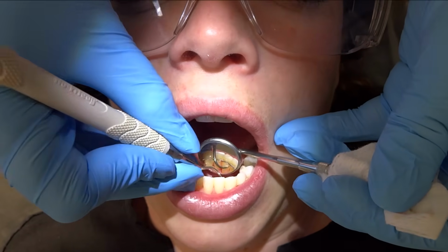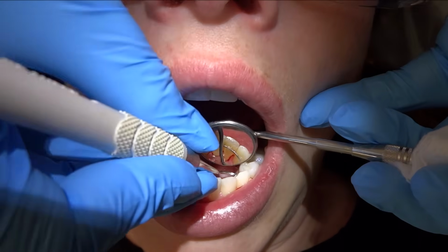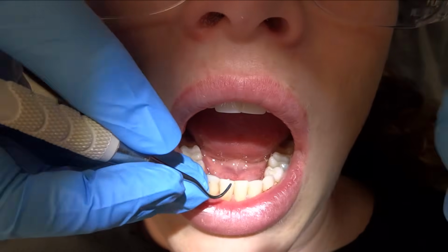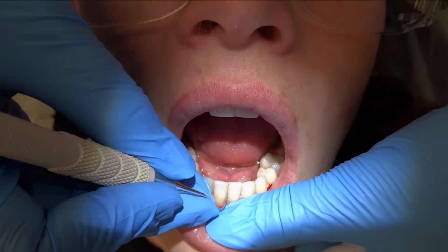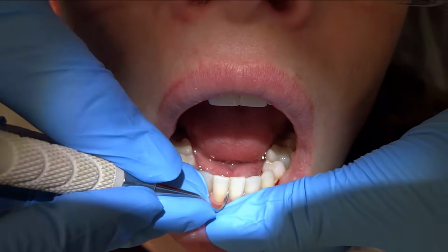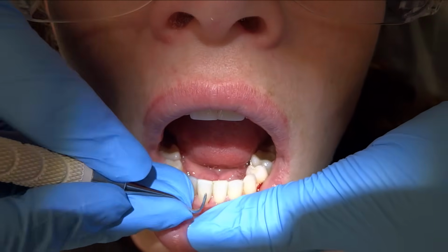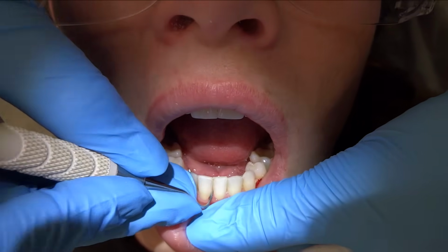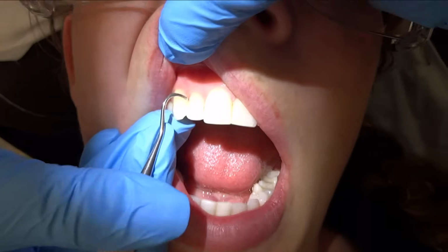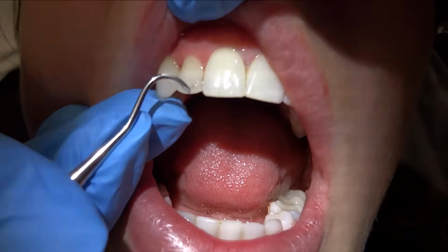One thing that's very painful to patients is if you get the instrument stuck right in between the contact. So to prevent that from happening, the stroke that I'm doing is always towards the contact. As I get towards the contact, I do an oblique stroke across the tooth instead of a vertical stroke into that contact. So just go into that contact and come oblique versus pulling straight up. See how oblique it's across the tooth.